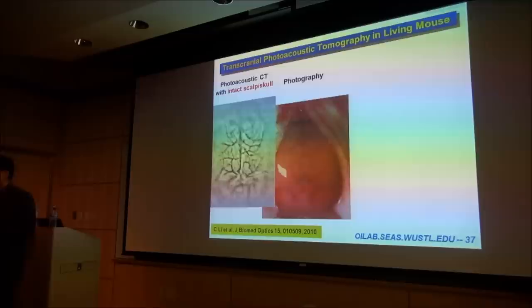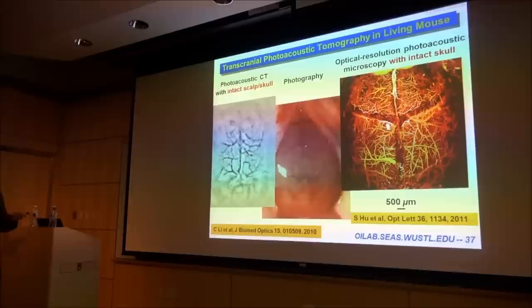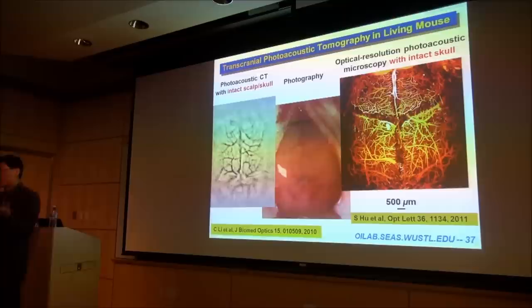Now, at this point, if you bring the higher resolution version, photoacoustic microscopy, the optical resolution version, you see something like this. So our vision will miss a lot of small vessels that are either deeper or just too small to see. We're now applying this technology with our neurology department for various disease models, stroke model, Alzheimer's disease model in mice.